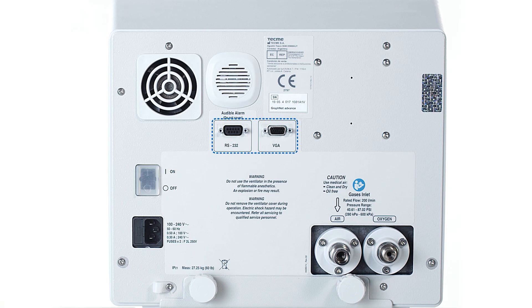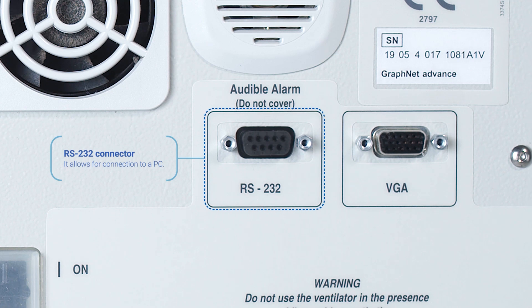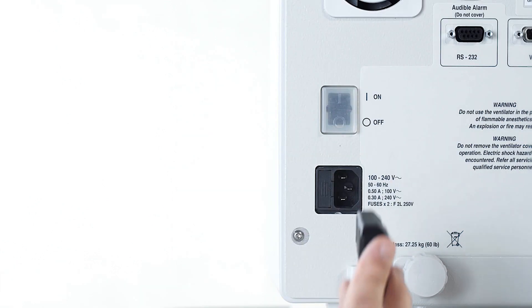Two connectors are located in the center of the panel: an RS232 connector to connect to a PC, and a VGA connector to connect to an external monitor.